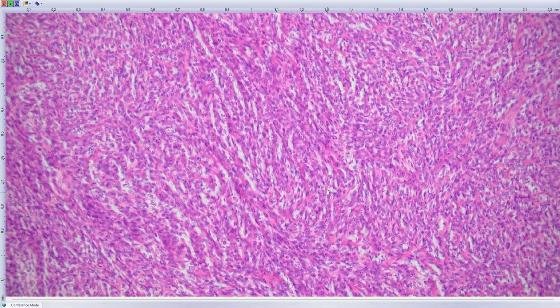Well, so the differential diagnosis is between benign myoepithelioma and myoepithelial carcinoma. And we did also immunostaining, which supports the diagnosis. It's PLAG1 positive. For this case, I do not have the immuno images, but it was SOX10 positive, S100 positive, and PLAG1 positive.